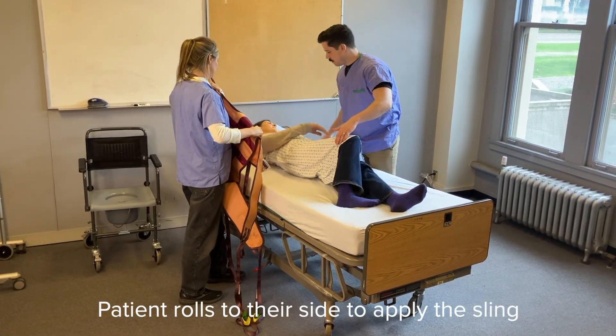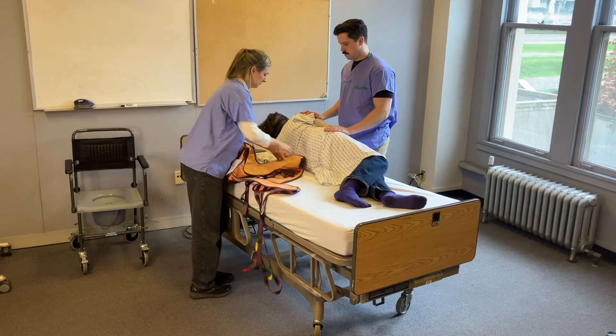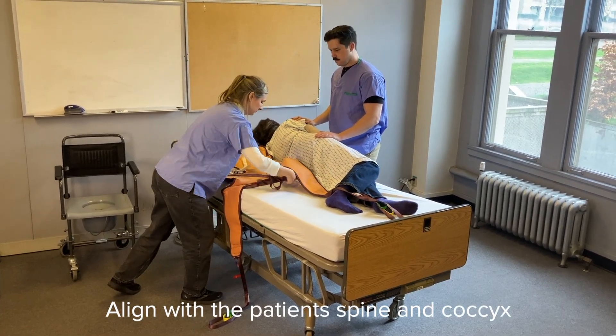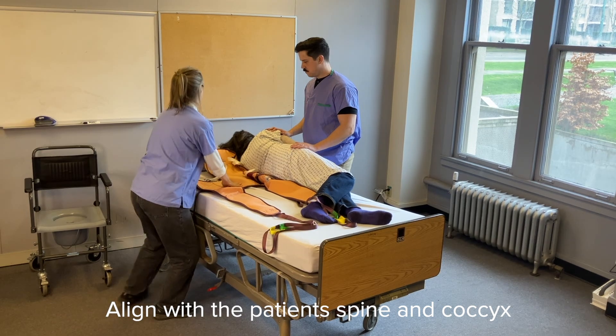Have the patient roll to their side to apply the sling. Ensure that the caregivers are providing no more than minimal assist and encourage the patient to do as much as they can for themselves. Make sure that the centre of the sling is aligned with the patient's spine and that the base of the sling is at the level of the patient's coccyx.